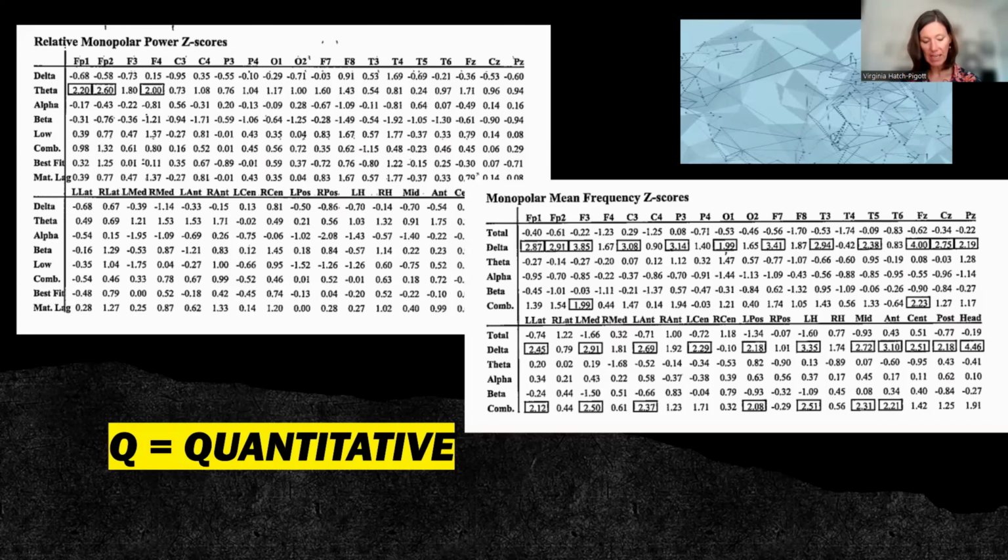Neurofeedback practitioners take EEGs and instead of inspecting them for spike wave deformities, as an epileptologist might do, they run them through databases which contain normal controls for each age and gender, from 2 months to 92, or some even 102. The databases quantify the mean power, the mean frequency, coherence, and phase for each bandwidth at each site.